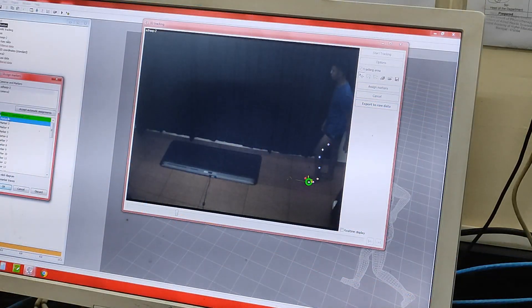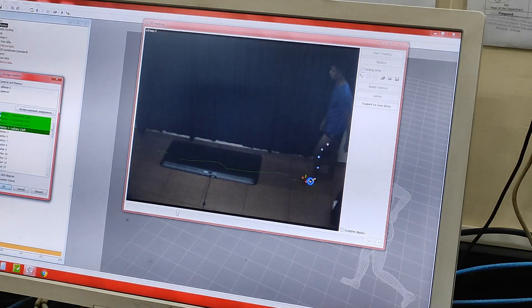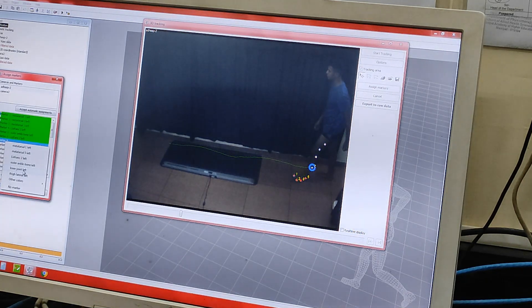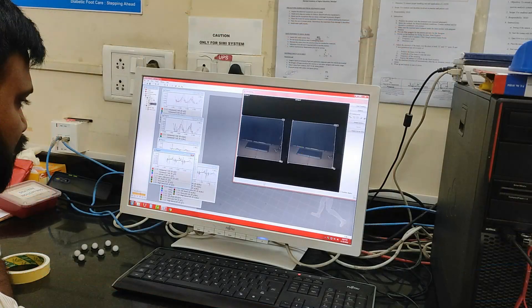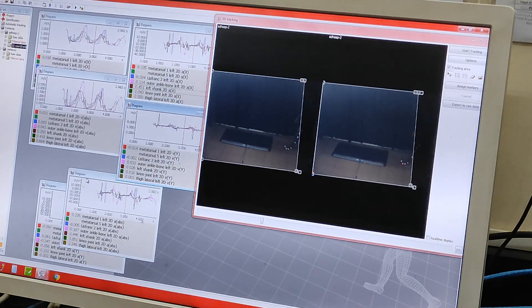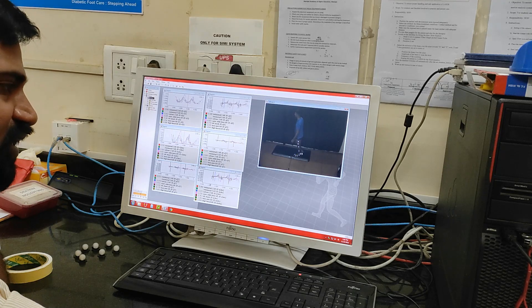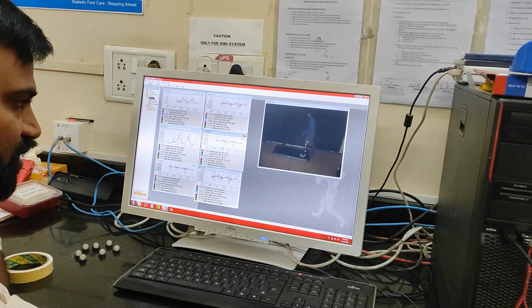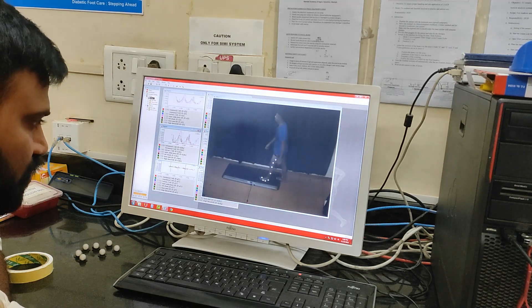Coming back to the kinematics or the movement, inside the software each point is marked with a name and is assigned a certain color. These points will be connected and the segments will be formed like a stick figure. When we analyze each point, the computer will tell us about the velocity at which a particular point is moving in space and also the acceleration of that point. These values vary, so in patients with diabetes where there is damage to the nerves, there can be reduced spatiotemporal parameters that can be accurately detected here.